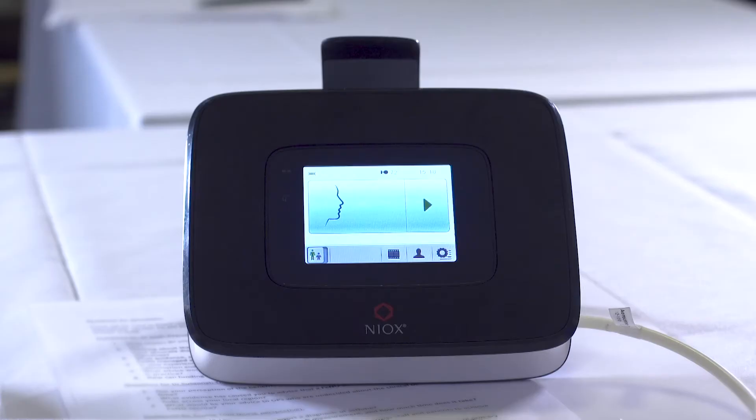This machine is called Niox and what I'm going to be doing is measuring your FeNO. FeNO stands for fraction of exhaled nitric oxide. Everybody exhales nitric oxide, but if you've got inflammation in your airways then your levels are going to be higher, and people with asthma exhale more nitric oxide than those without. So what I'm hoping is this will give me a number that confirms what I clinically think.